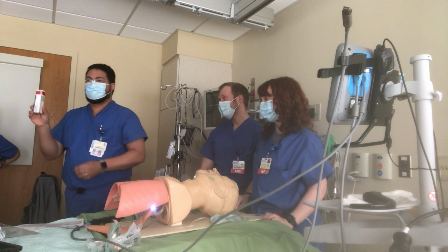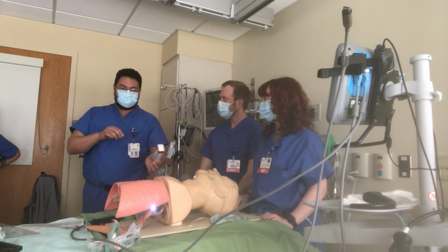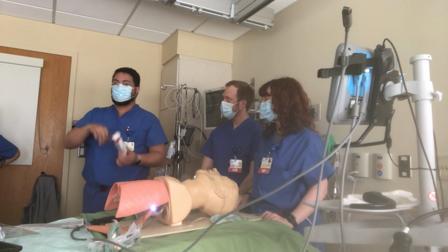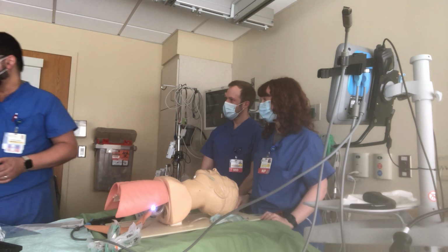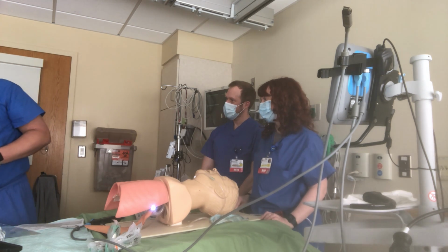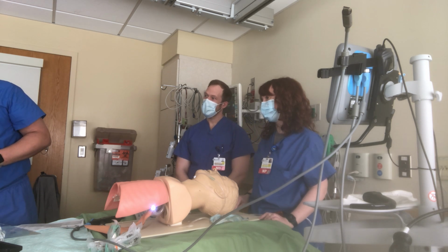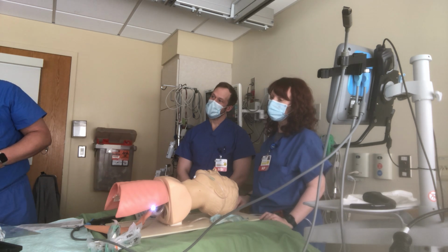Lidocaine ointment. Right? So the lidocaine ointment is to numb what? Not for the patient. This is ointment, so it actually sticks. So it numbs the airway itself, like the actual airway. So if you open the second drawer, third drawer, I don't know where they are. This one here on the left side. See this orange, and yeah.